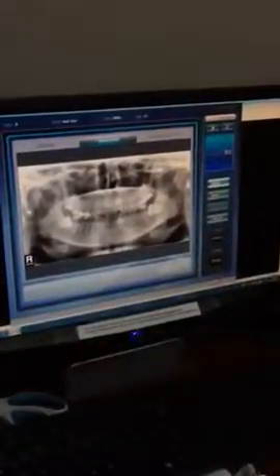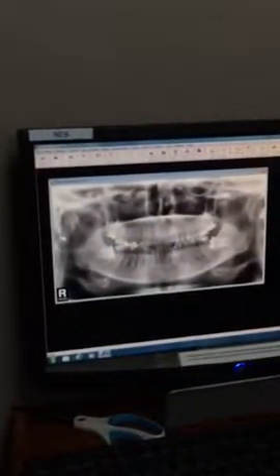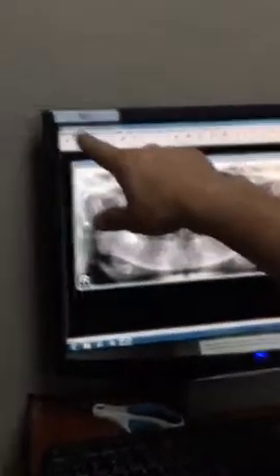There are some additional features which this machine doesn't have, but you'd always follow the manual. Do you want to save the captured image? Okay. And then that saves it under the computer, but not in the patient database yet. So then you say okay, and now the image has been saved, in this case, in the patient test.